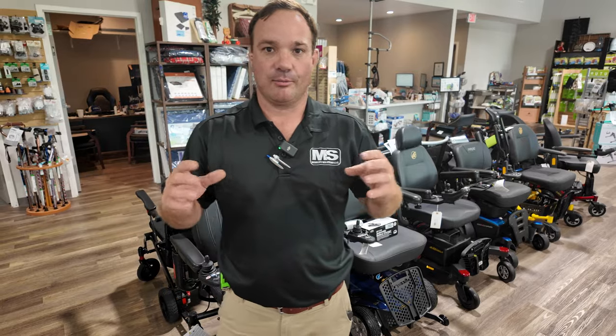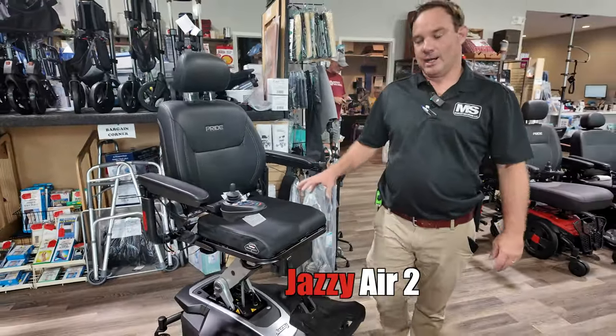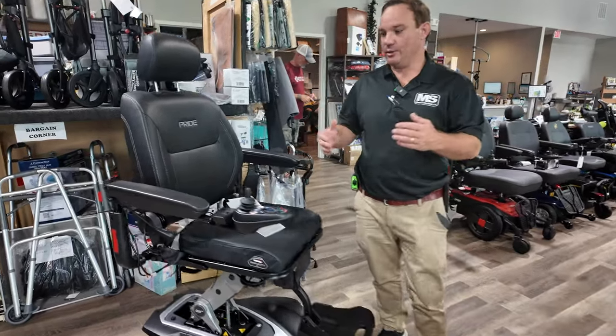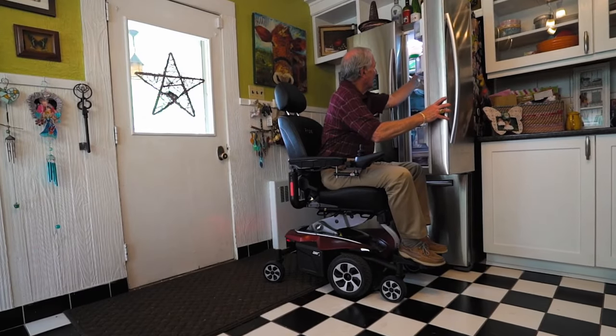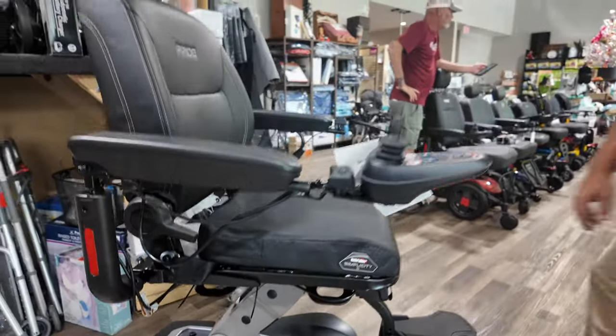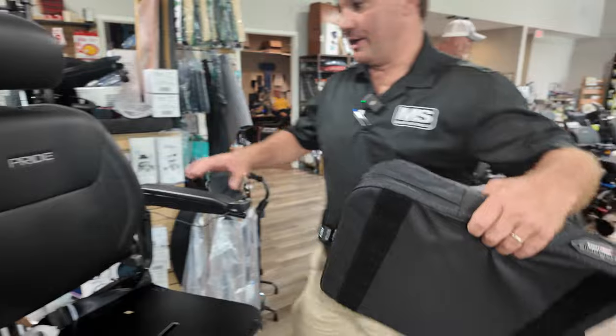This is the Pride Jazzy Air 2 power wheelchair with elevated seat. This is going to allow you to get higher up to cook, to get stuff out of your cabinets, to have more eye contact with someone, and also help get up and out of the chair. You can buy this chair in different seating options.